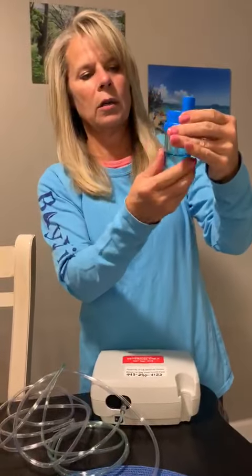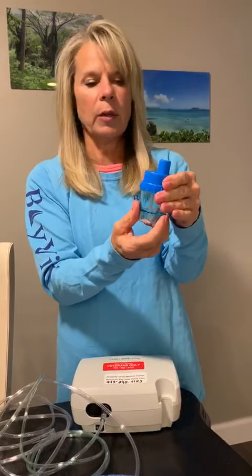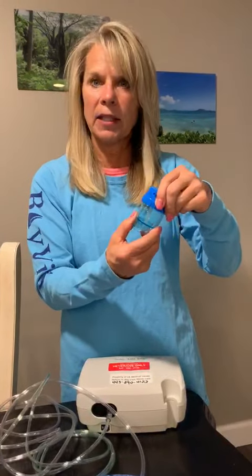You can also soak the lid and the bottom in a one-third vinegar, two-thirds water solution once a week for 30 minutes, then wash it in warm soapy water, rinse it, let it air dry, and put it back together. That just gets it a little bit more clean.